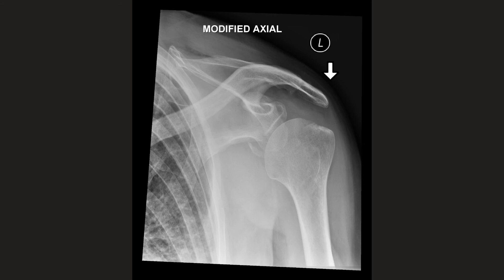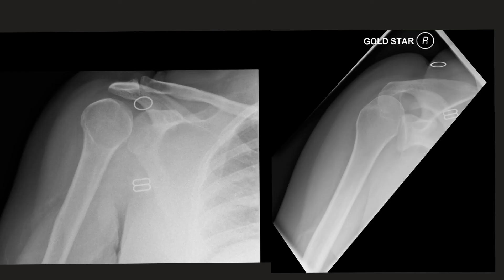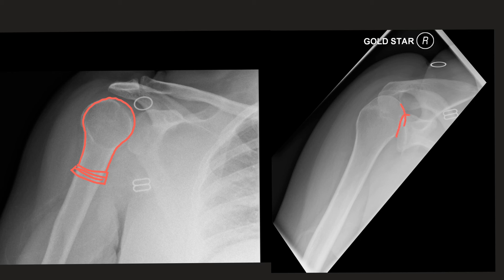Here is another example of a bony Bankart. Moving on to the next case, you can see that the humeral head has a slightly strange morphology — looking closely, it resembles a light bulb. This is in keeping with the light bulb sign of a posterior dislocation, and on the modified view you can see overlapping of the glenoid and the humeral head, again suggesting a posterior dislocation.